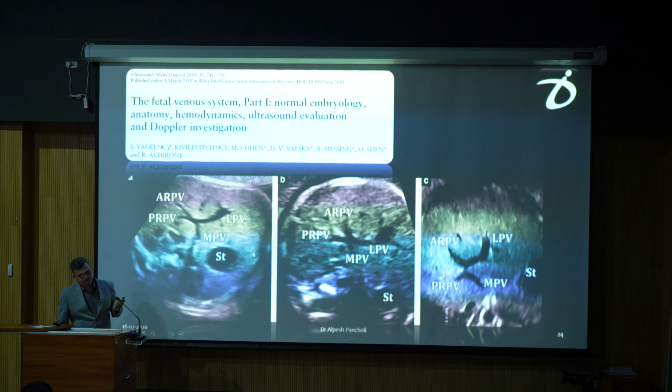Now there are three variations. It can either be joining as a T or X or H. Okay, ultimately they are the variations. This is the most common type and this is the least common.